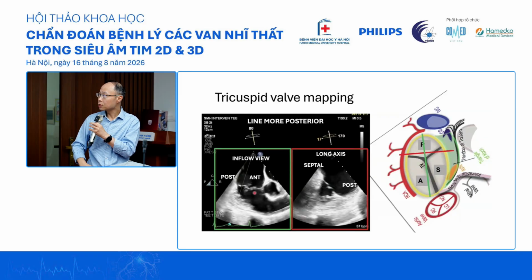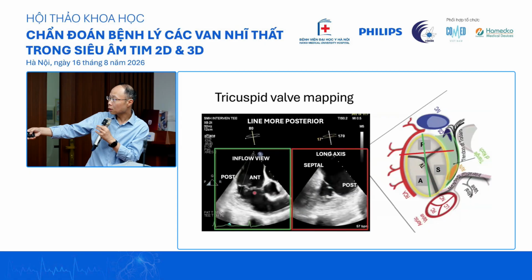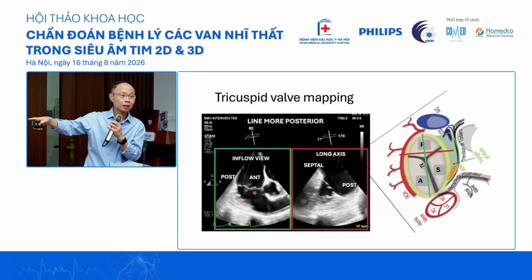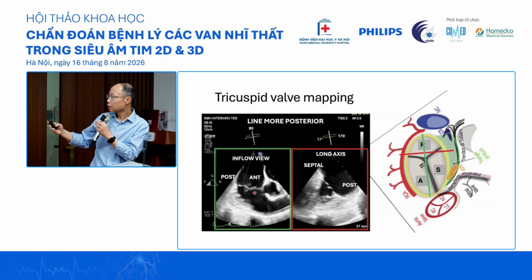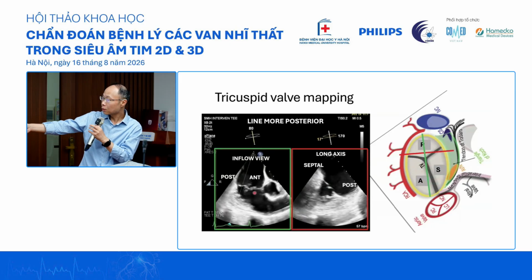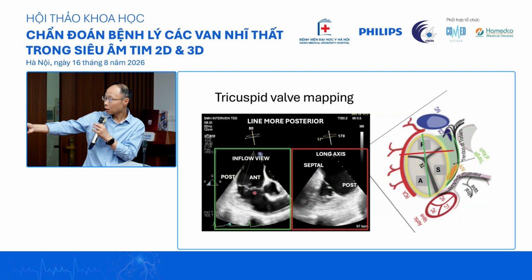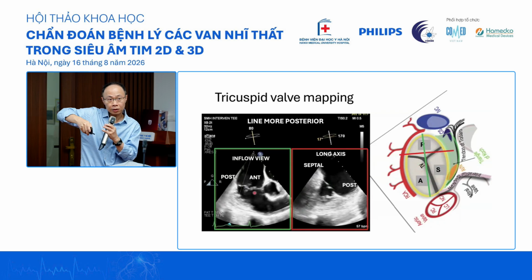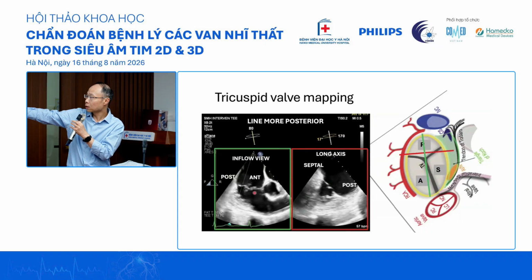The next one is this. Later on we might be able to show you, you can actually leave a marker to label it. This is P, this is A, and later on when you turn around, it actually stays with you. And if you then expose more, just tilt it over, same, but turn over slightly to see the full view of your aorta. Then you are cutting right up here, A and P all the way.